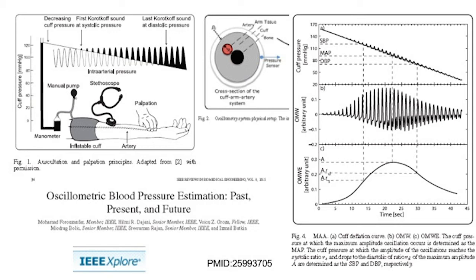Now, physiologically, it makes sense because that's what the body measures. We don't treat mean arterial pressure, at least not in clinic. We treat systolic and diastolic. And so that mean arterial pressure is the key here, and getting that waveform envelope to read the mean arterial pressure then begins the secret sauce approach to how to develop the systolic and the diastolic pressure.